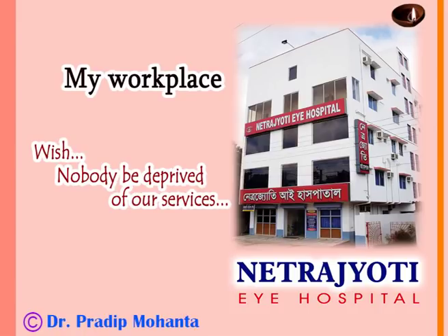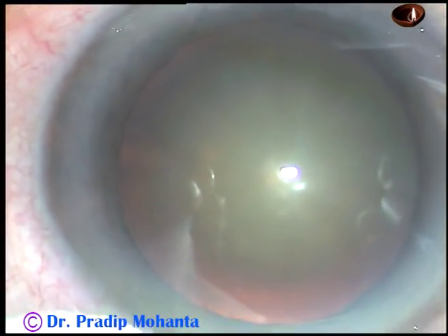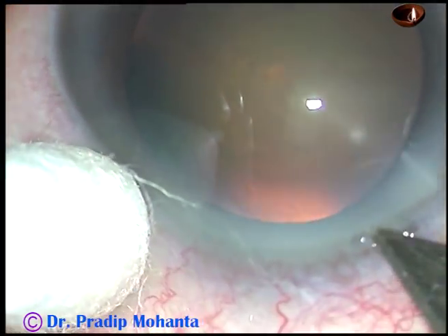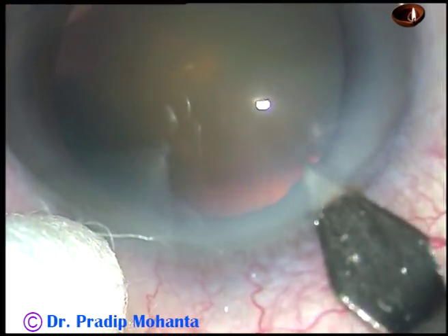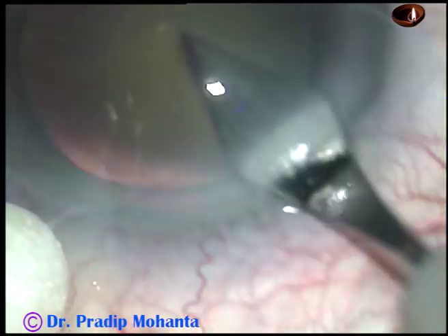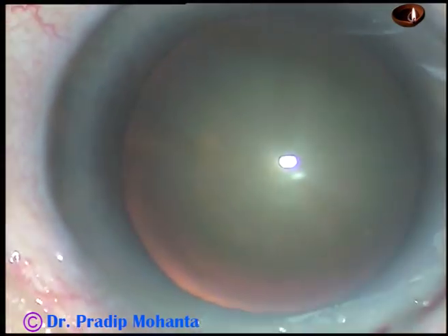Dear colleagues, welcome to my hospital at Ranaghat, West Bengal, India. This is a cataract of moderate density in a highly hypermetropic and amblyopic eye. I have taken up this case for surgery. Let us see what happened and how I managed the case.